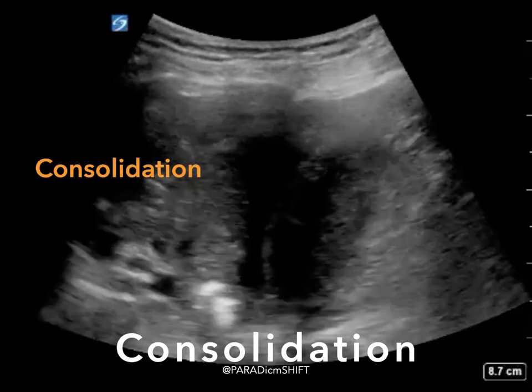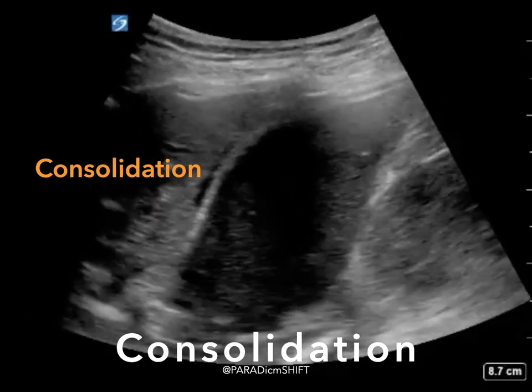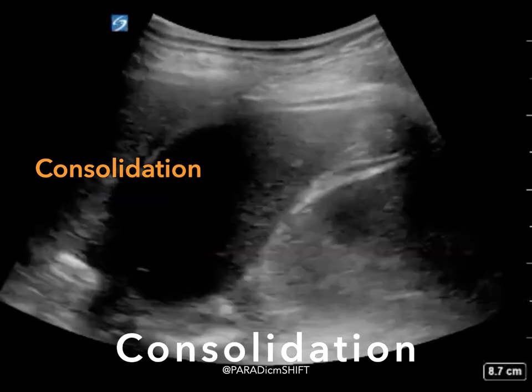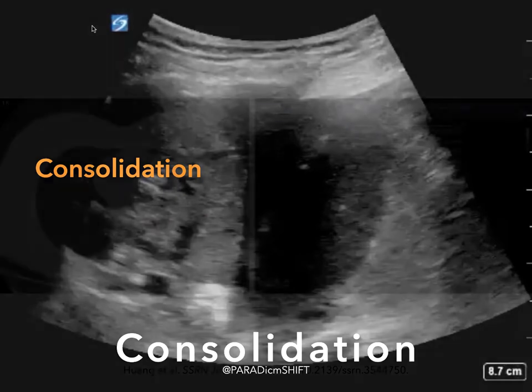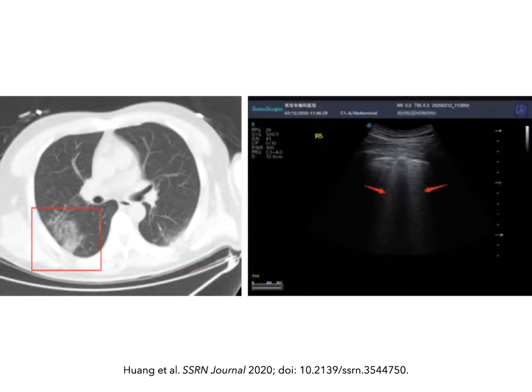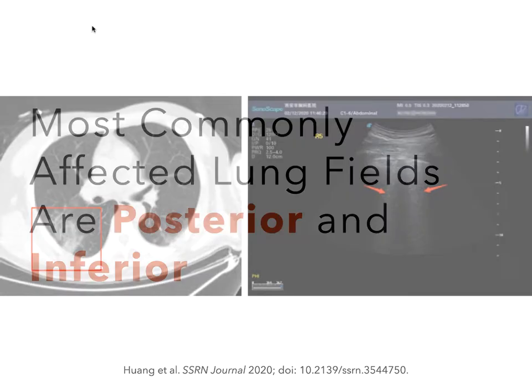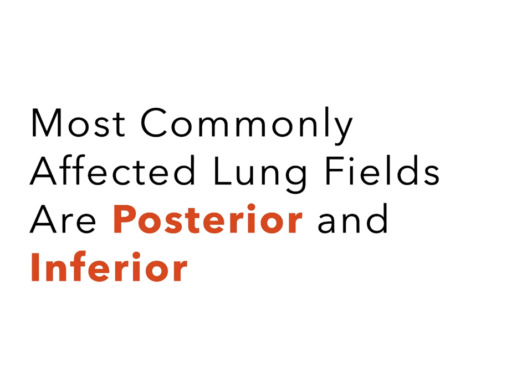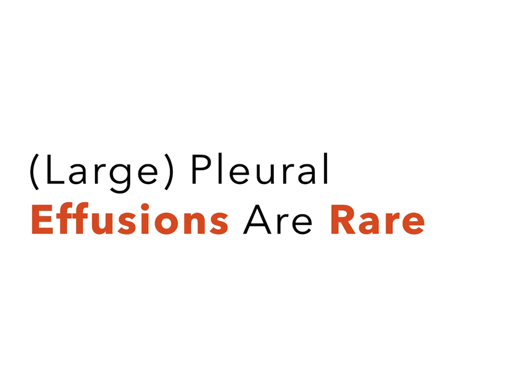Here's an example of a consolidation in a patient with COVID. The tissue-like density is above the diaphragm, so we know it's consolidation instead of a solid organ. The Huang paper does a great job of correlating CT images with ultrasound findings — pleural-based lesions on CT correspond to the pleural irregularity and thickening we see on ultrasound, and ground glass opacities on CT correspond to the B lines we see on ultrasound. The most commonly affected lung fields are posterior and inferior, so these will be the highest-yield zones to scan. These patients will almost never have findings in the anterior zones. Furthermore, pleural effusions — especially large ones — are rare.